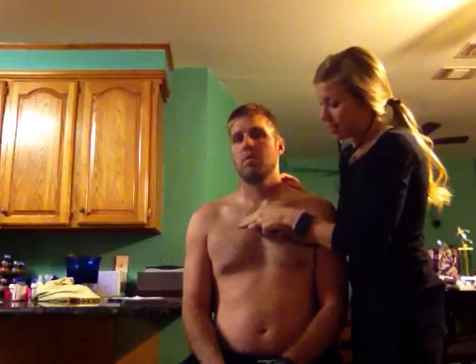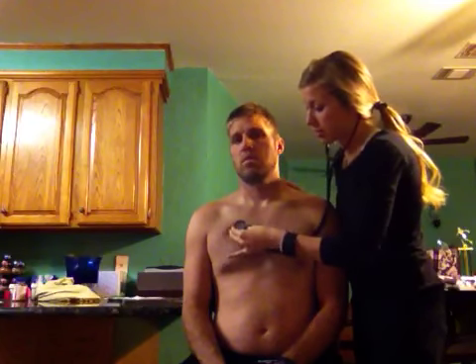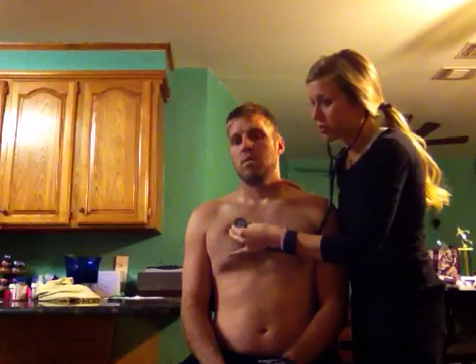a normal size. So we'll move on to auscultation of the heart sounds, and I'm listening for S1, S2, and maybe S3, S4, and just want to make sure that I don't hear any murmurs, gallops, or rubs. So we'll start by listening to the first part, which is the aortic area, and that's in the second right intercostal space. And you can just breathe normal through this.